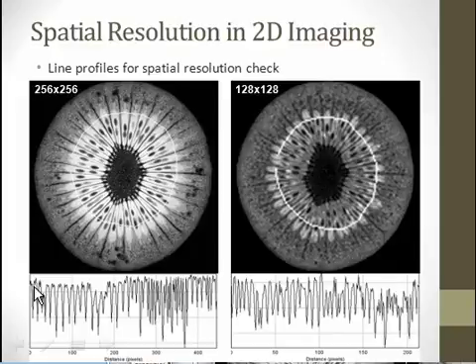quality of spatial resolution is to take a profile, or draw a line through an image and look at the profile. So what I've done is I've drawn a line, this white line. It may be hard for you to see. I've drawn a white line around here, and I'm showing on the line this curve down here.